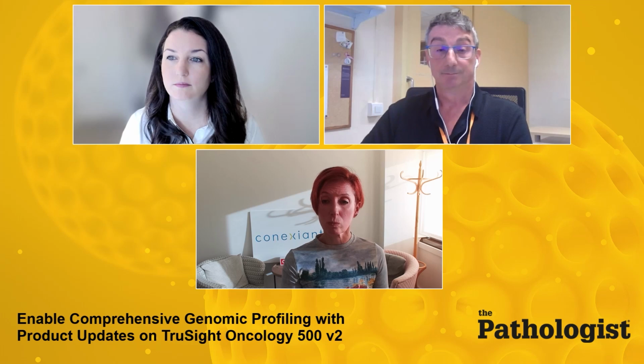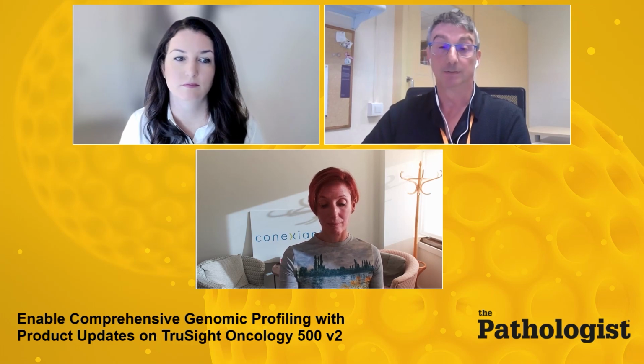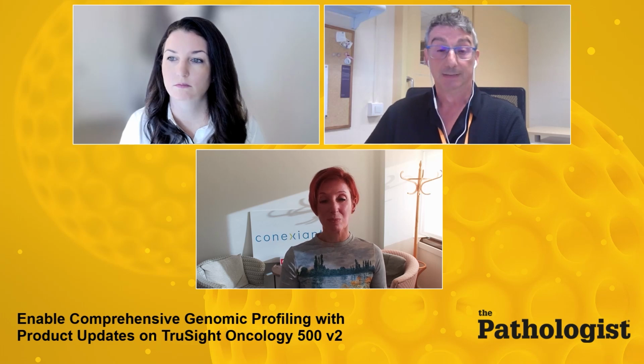Yes. We can start with around 50 nanograms DNA RNA if the biopsy allows. However, some biopsies are very small, for example, lung biopsy, and the amounts of DNA and RNA that we obtain are very low. If there is no option to obtain more material, we proceed with the libraries anyway.